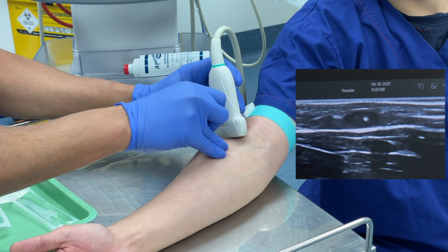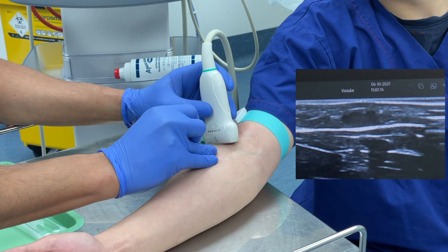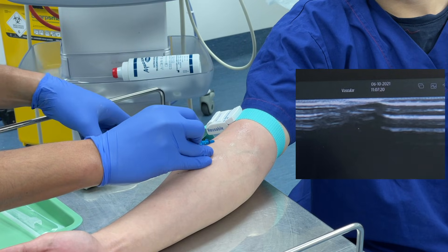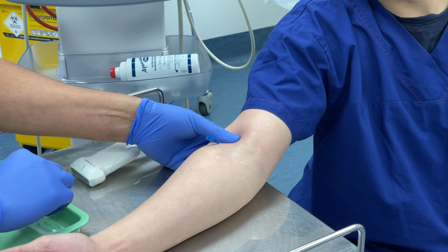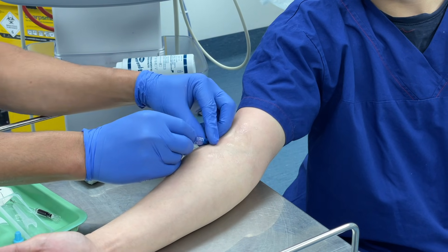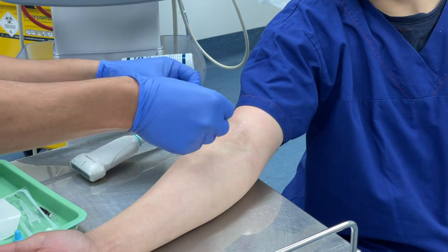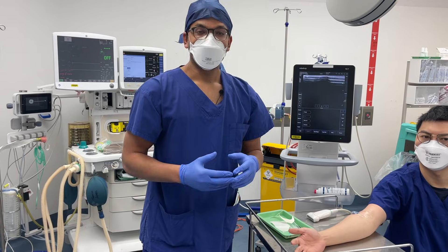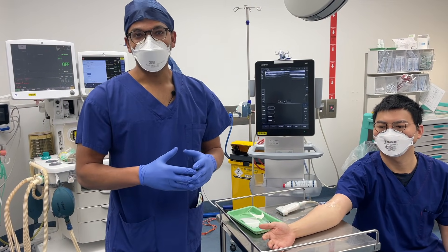You can see the cannula tip on the screen, centered in the vein — I know I'm in the right spot. I advance it a little and thread it through, which goes in nicely. I put the ultrasound probe down, release the tourniquet, apply gentle pressure, make sure the shaft is secure, and put the cap on — making sure there's minimal blood coming back. I apply a tegaderm dressing, and we're good to go. We'll flush that to confirm it's working. Thanks very much for watching and tuning in for more ultrasound-guided vascular access videos.